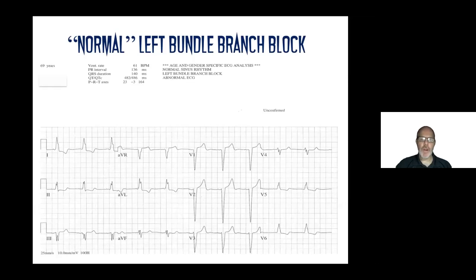If you look at this tracing on your screen, you'll notice that wherever the QRS is, and again, I use the term QRS generically because not all of these are QRSs, right? Again, that's a conversation for another day. But if you look at where all the QRSs are pointing, the ST segments are going in the opposite direction. Look up there in lead one. Your QRS complex is going up, but you have ST segment depression.